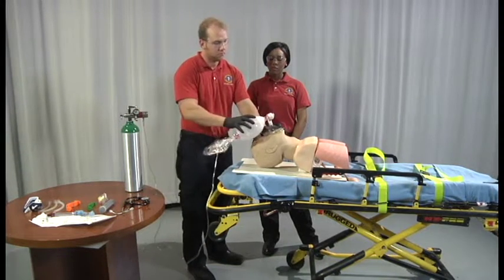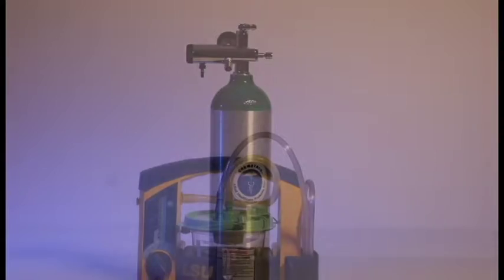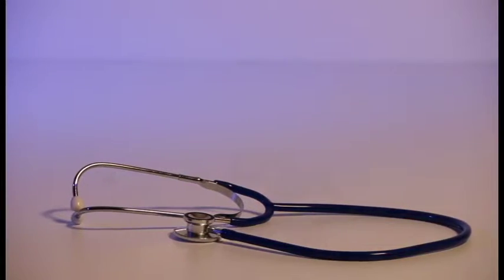Gather all necessary equipment to perform this skill. Equipment should include oxygen, suction device, appropriately sized alternative airway device, stethoscope, and capnography.